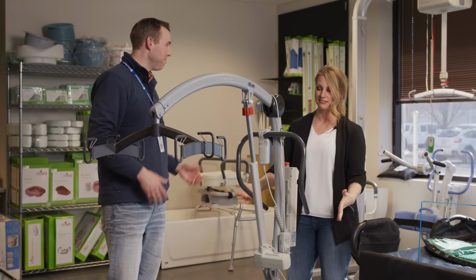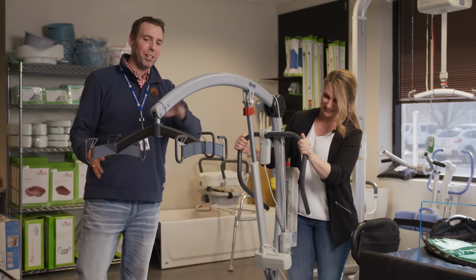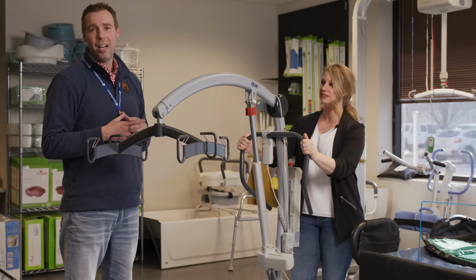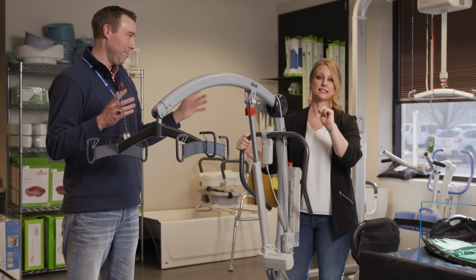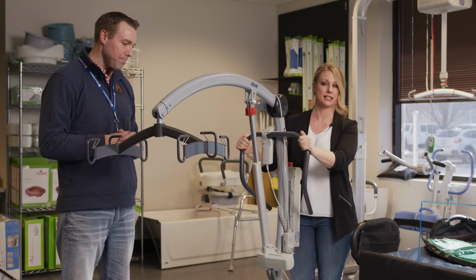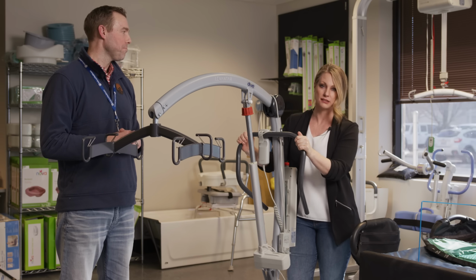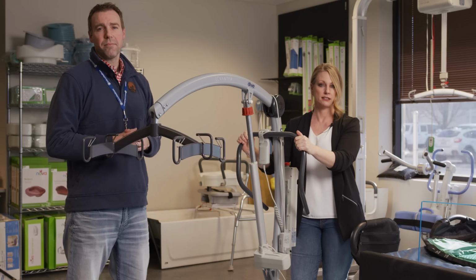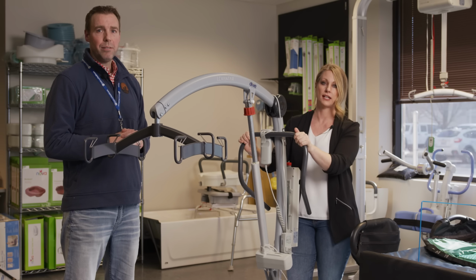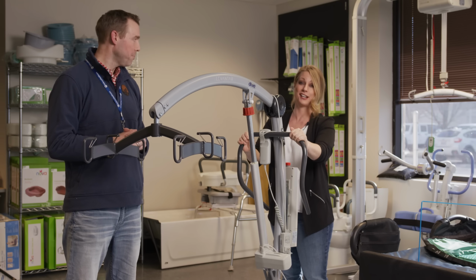I feel like this is the Cadillac version of Hoyer lifts, I'm not going to lie. This is an upgraded version. If you were to go through your insurance, it would not be electric, for example. Oh, yes, I would like to mention that. It's really important that you have an electric Hoyer lift. A manual hydraulic is really going to be hard on the body. So if at all possible, it's within your resources, your ALS loaner closet, your MDA loaner closet, wherever you are, if you're able to get a battery-powered Hoyer lift, you're really going to need that much more over hydraulic.